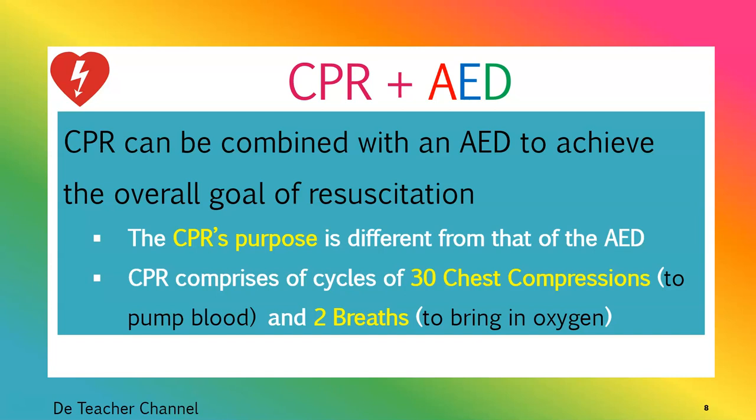So you can see the difference there. But the two of them work together toward achieving the overall goal. And when the two are combined, the result is always the best.